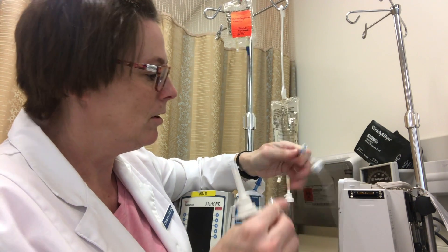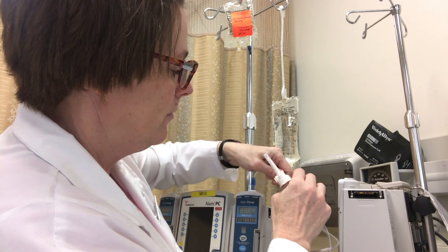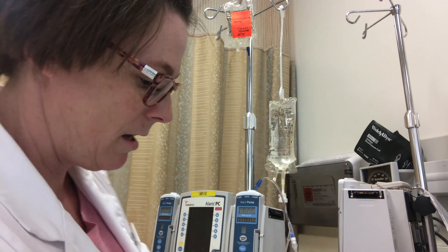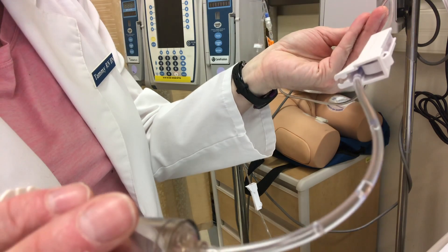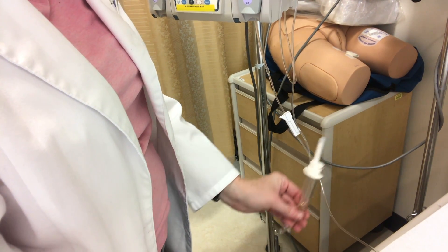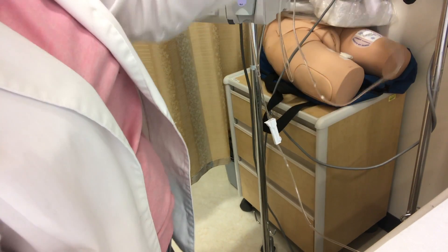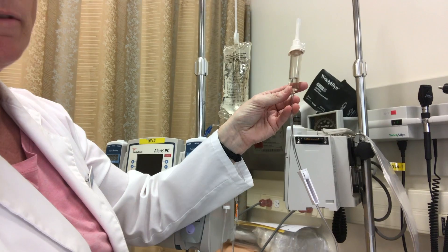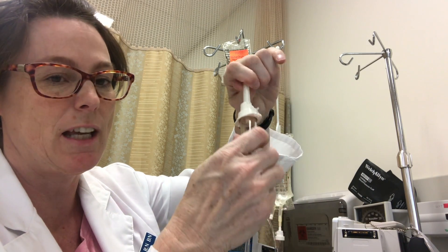I'm going to attach my port here, and if I hold this down lower than my primary bag the fluid will run. You can see it's starting to fill in my secondary chamber, and that's good enough. All I have to do is simply raise it up and it will stop filling.